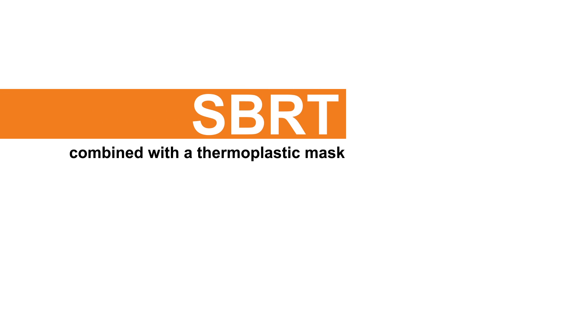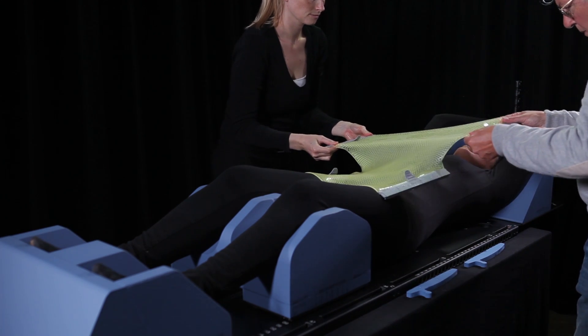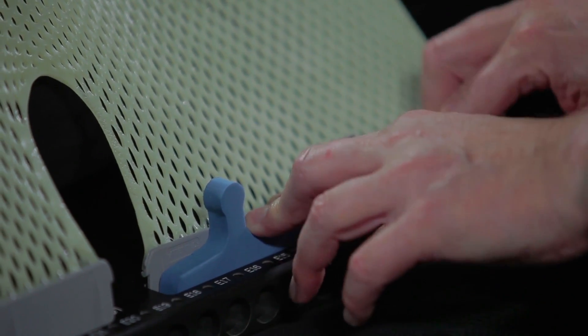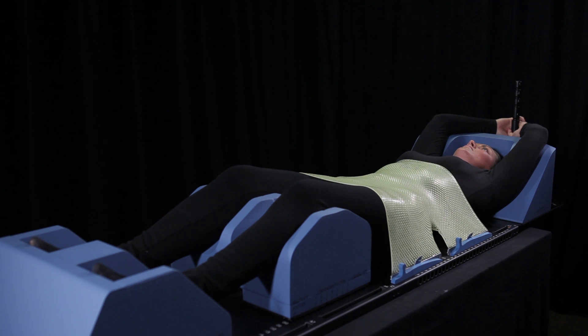The SBRT solution can be combined with the thermoplastic mask. A thermoplastic mask to immobilize the patient can be molded to increase the precision of the treatment. As an example, a pelvis mask will be molded. Place the pre-cut over the pelvis of the patient. First attach the top profiles in the slots in the baseplate and fix them with the blue EVA blocks, then attach the two bottom profiles. Make sure the mask fits snugly around the patient's pelvis.